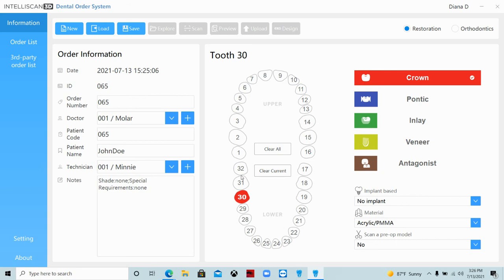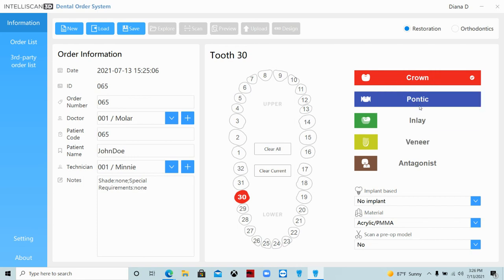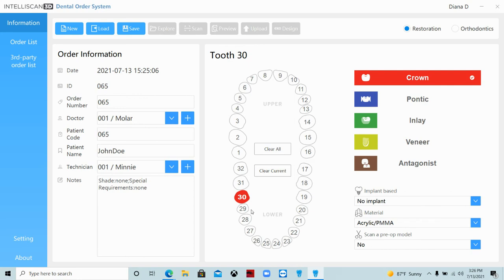You can't save it yet until you choose a tooth number. So you can choose multiple tooth numbers, of course, if it's multiple crowns or a bridge. It automatically defaults to crown. You can change that to a pontic, whatever it is that you're doing at the time. At this point, whatever is blue, highlighted blue, you're able to use.